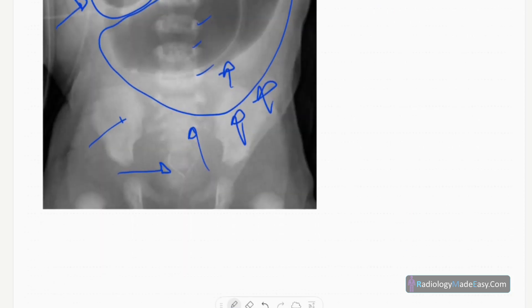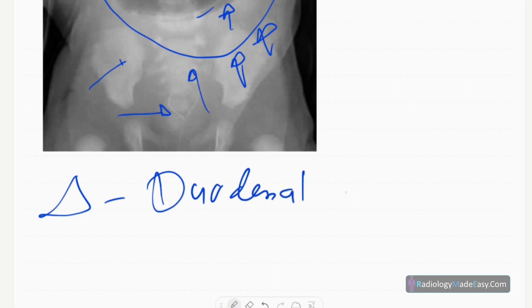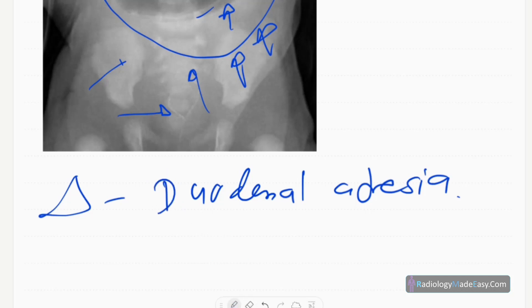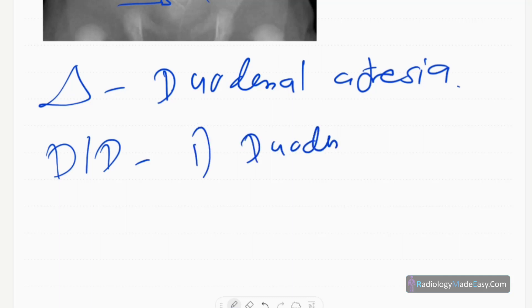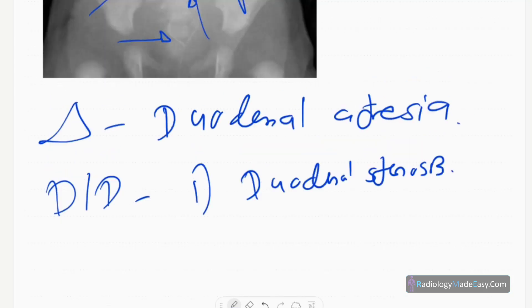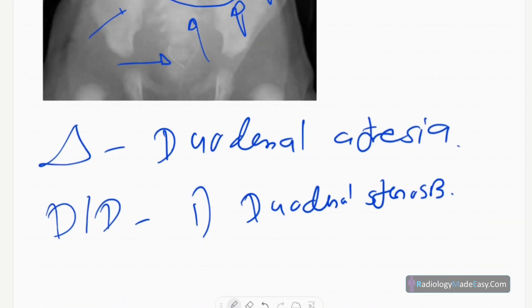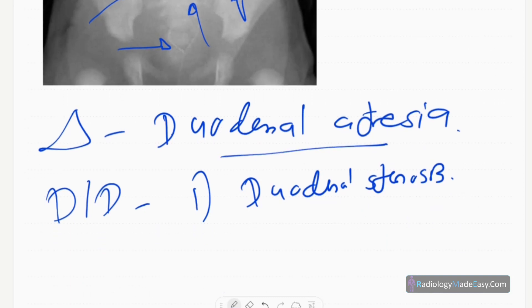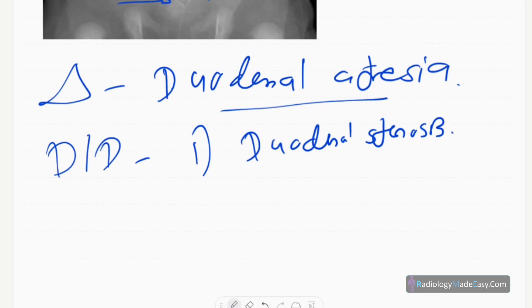The diagnosis in this case is duodenal atresia. This means the lumen is not canalized, so there is obstruction to the lumen. Differential diagnoses include duodenal stenosis — you can't exclude those by X-ray alone.